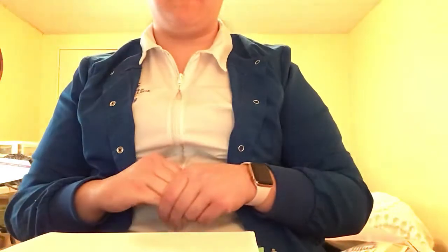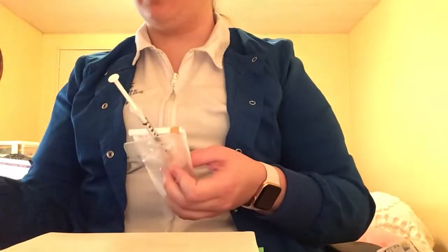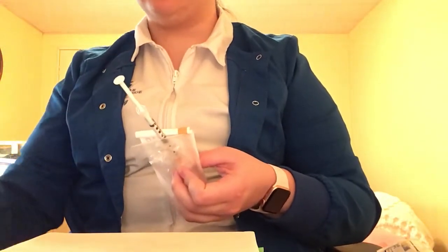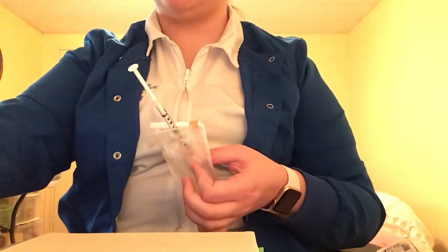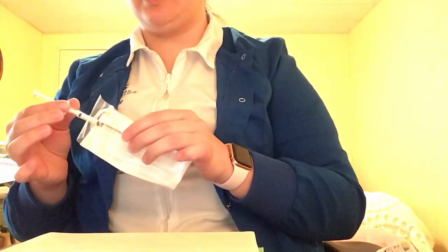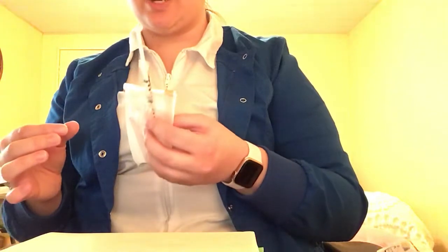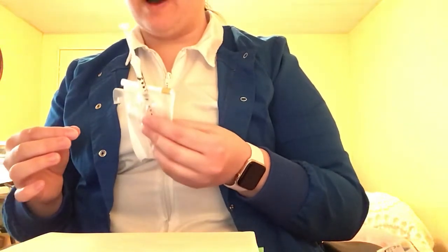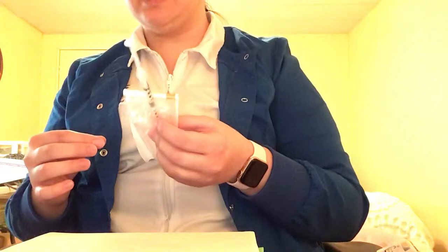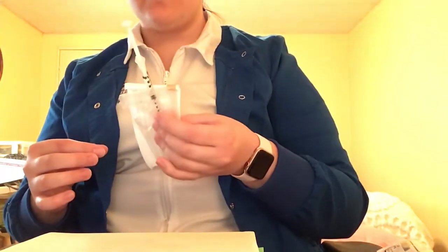And then I would go ahead, before I give her the injections, I would perform my third set of rights. So I would go ahead and verify with my subcutaneous injection that this is for Anna Powolowski, date of birth May 5th, 1957. She has an allergy to penicillin, and her reaction is hives. This is going to be a B12 subcutaneous injection with an amount of 500 micrograms at 0.5 mLs, and the route would be subcutaneous, and the time would be 16:20, which is right now.